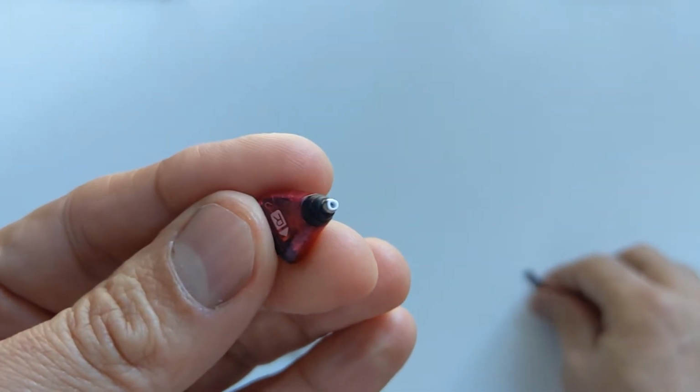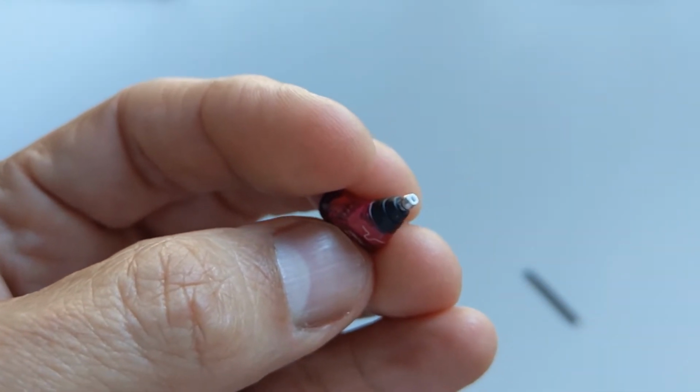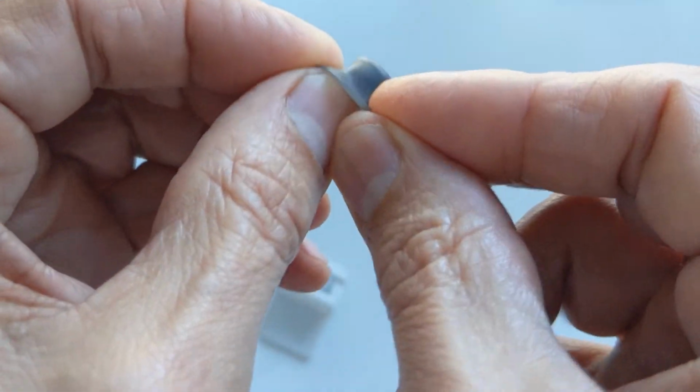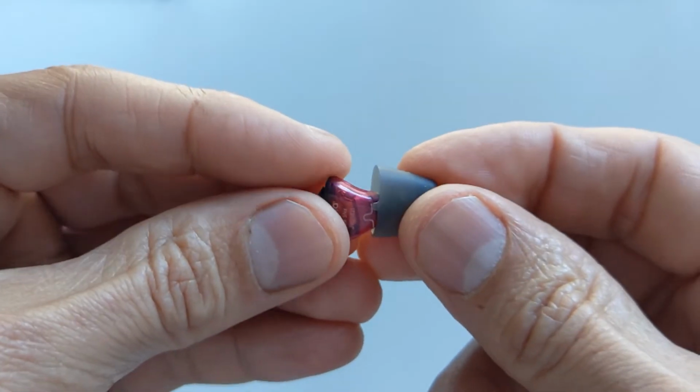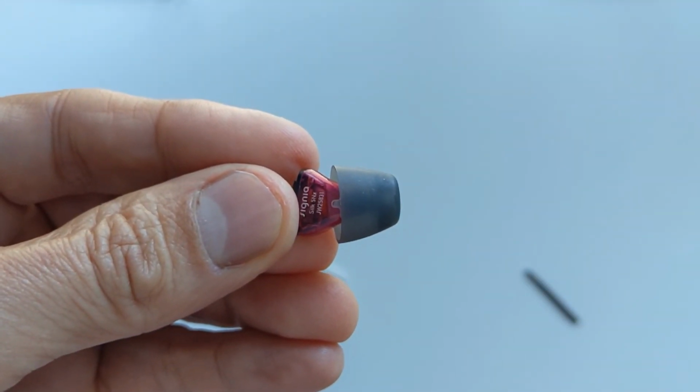You've now got a new miniR wax guard in the end of your hearing aid, and all that's left is to replace the Signia click sleeve over the end, like so. All done.